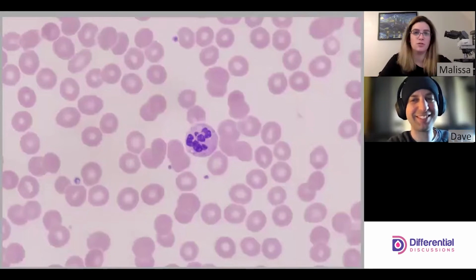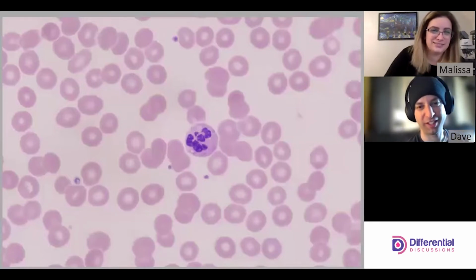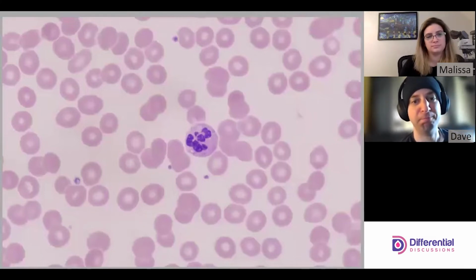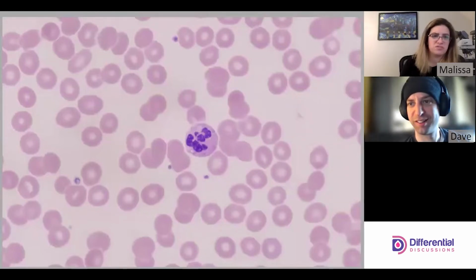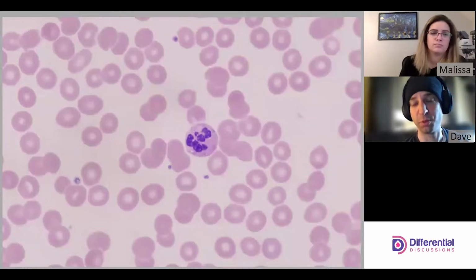We're going to talk about megaloblastic anemias. So megaloblastic. Mega. The general picture here is big red cells, macrocytes, right? I don't know how much we want to go into pathophysiology. I think we could do similar, just the basics. Okay. So megaloblastic anemia develops from a deficiency in either folate or B12.